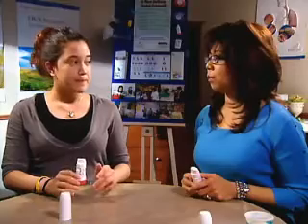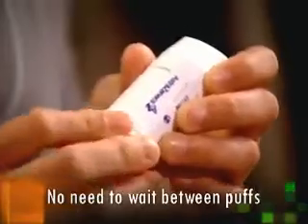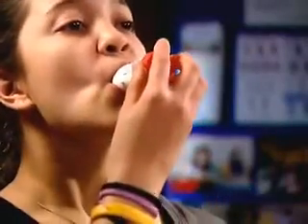Because the device is breath actuated, there's no need to wait between puffs. A second dose can be taken immediately after counting to 10 and reloading, as opposed to MDIs, which require up to 1 minute to repressurize the propellant.